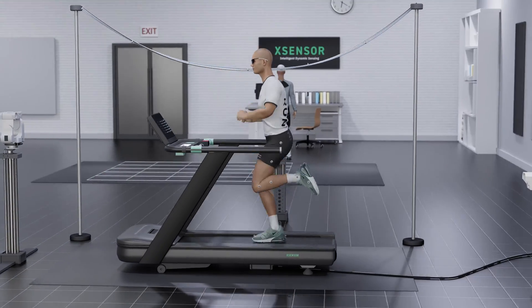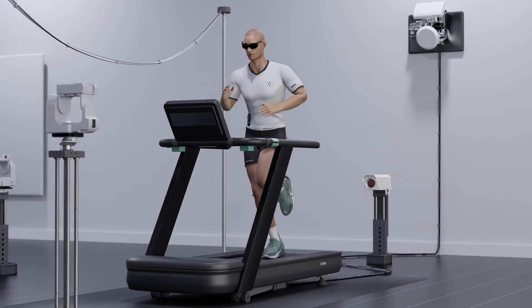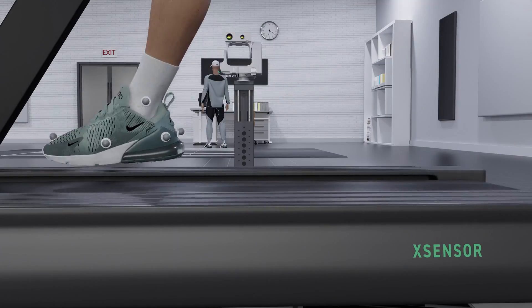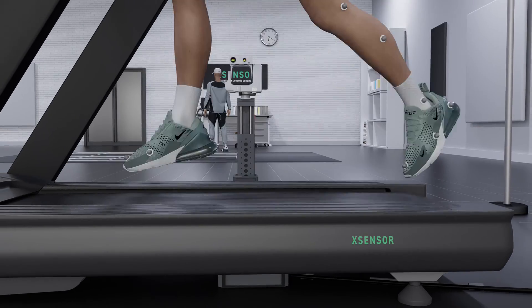Existing plantar pressure and gait measurement devices are not suitable for real-world testing. Until now, the data captured using these systems was recorded in a lab setting, missing the details and nuances of natural motion wherever it occurs.